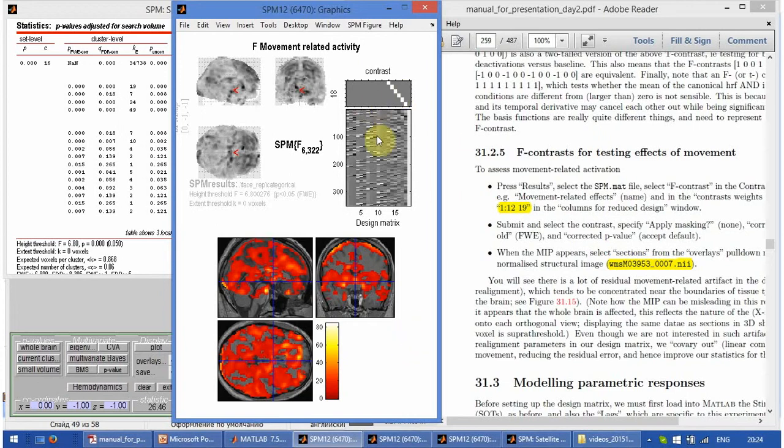So we just model all the displacement parameters, and all this activity is not taken into account, or as it is called, controlled for, when we examine the other conditions.